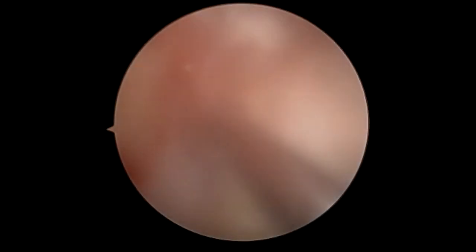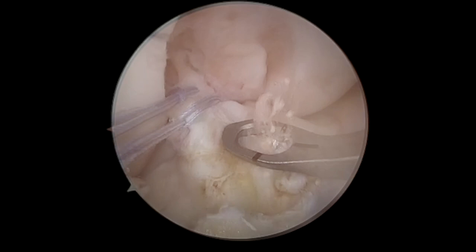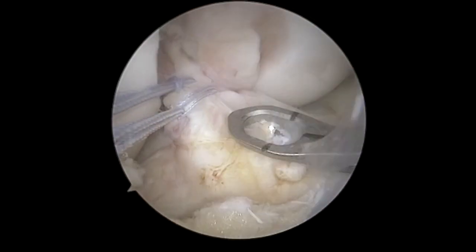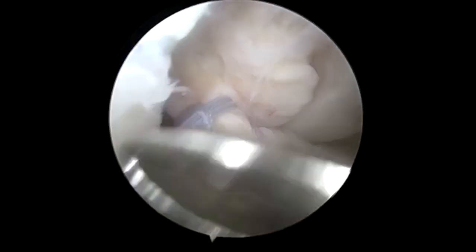Following this we're going to put the spade tip drill and go all the way through, drilling approximately where we want the ACL to repair back to. Then we're going to use the bowl guide with a 3.0 cannulated drill.